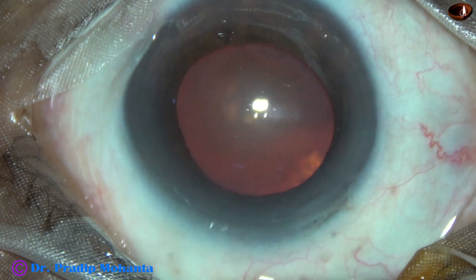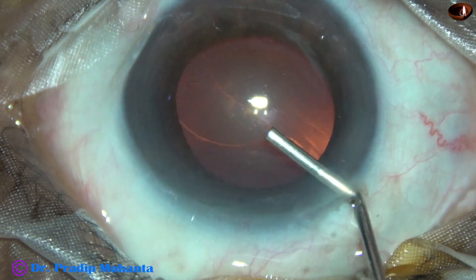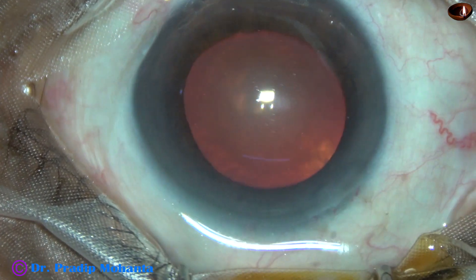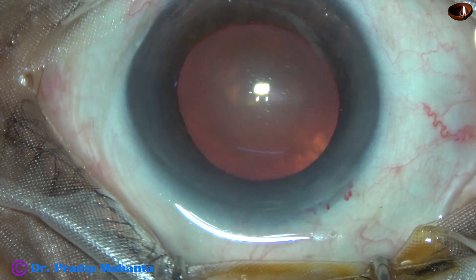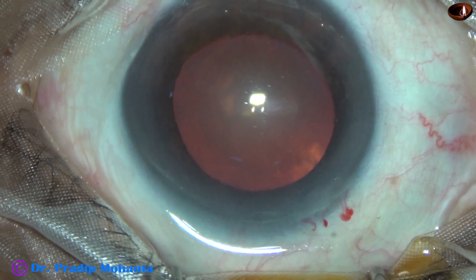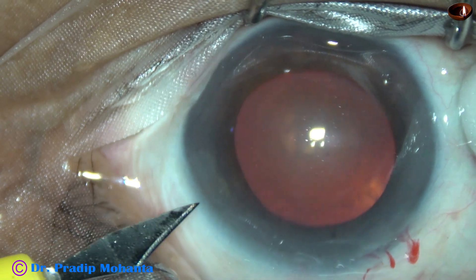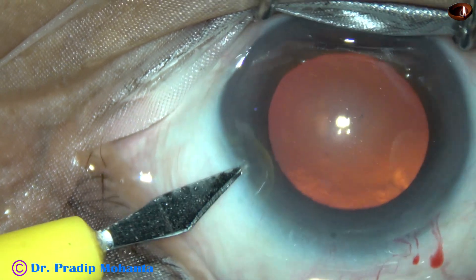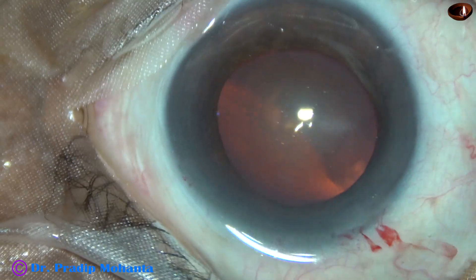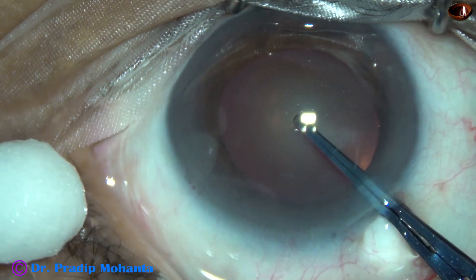This is the main incision with a 2.8 millimeter steel keratome on the posterior aspect of the limbus, and I have included a bit of conjunctiva in this in the anterior lip of the main wound. This is a side port on the left side of the main incision about 3 o'clock hours away, and in this case I have made only one side port.